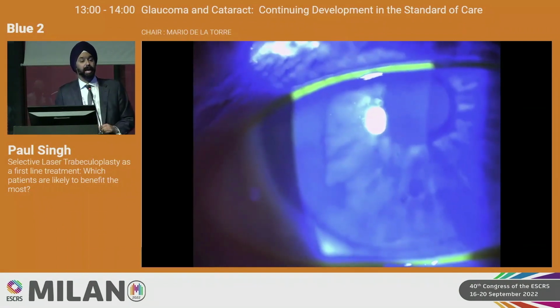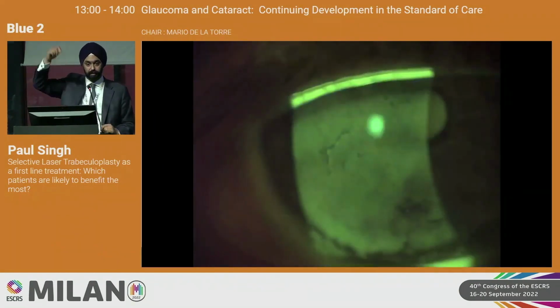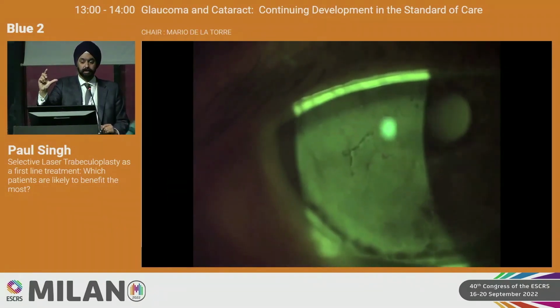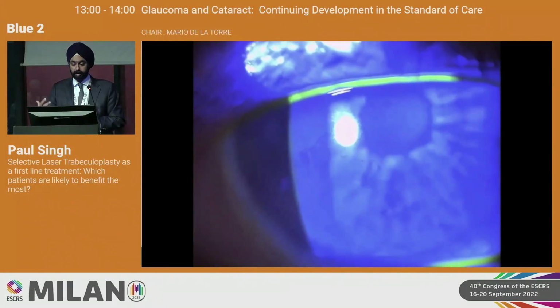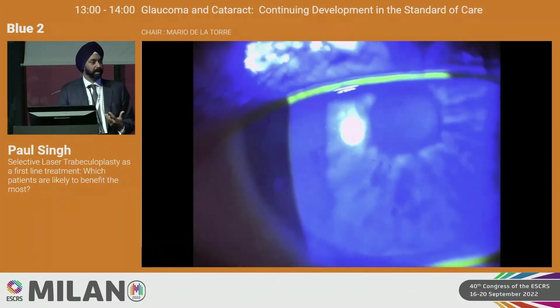Number two, use something called a Wratten filter. There's a filter you can buy. Now, we have a slit lamp that has an automatic filter on it. But you can use Amazon, which has these $10 filters called a Wratten filter, which allows you to see the tear film so much better compared to a cobalt blue light. There's a blue light, and here's the filter. And you see that EBMD, the unhealthy ocular surface.